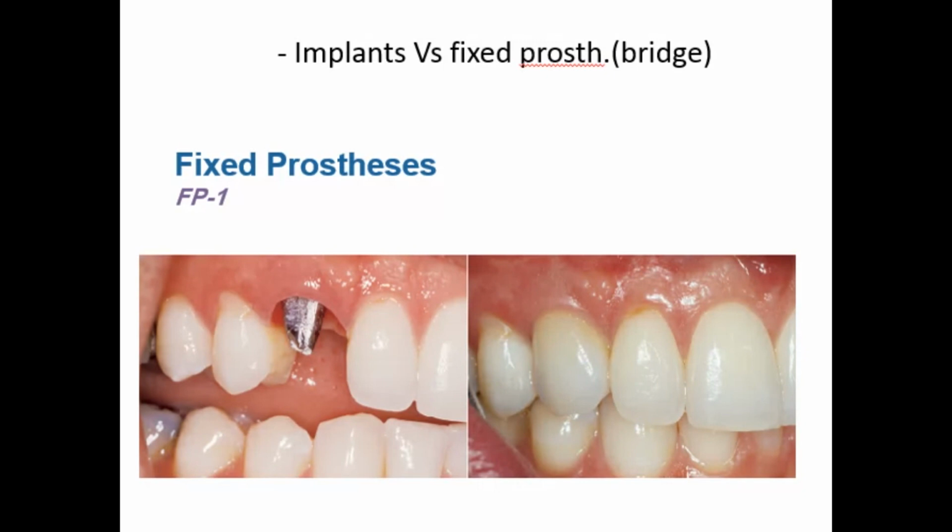First, the fixed prosthesis. I have FP1. FP1 is a fixed restoration and appears to the patient to replace only the anatomical crowns of the missing natural teeth. To fabricate this restoration type, there must be minimal loss of hard and soft tissues. The volume and position of the residual bone must permit ideal placement of the implant in a location similar to the root of a natural tooth.